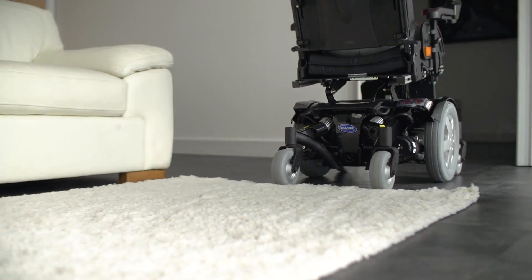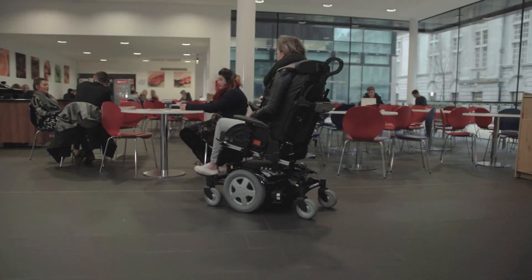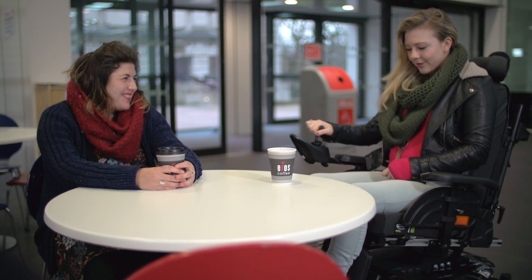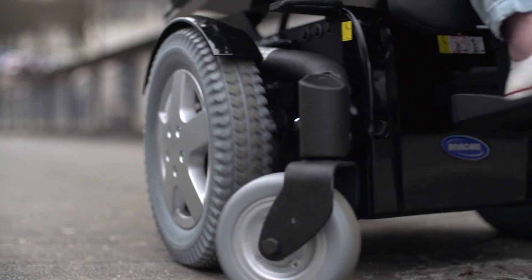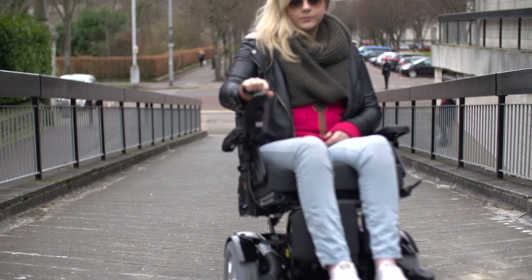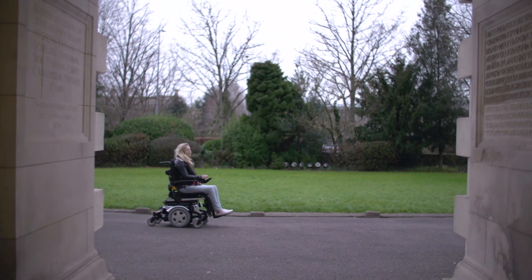Another concern is accurate low speed control, for example while going through doorways or approaching a table, as a number of corrective actions are needed to get the power chair to the correct position. Lastly, there is poor slope hold, which when the chair stops can cause it to slightly roll back when the user starts driving again. This can leave the user feeling nervous and lacking confidence in the power chair.